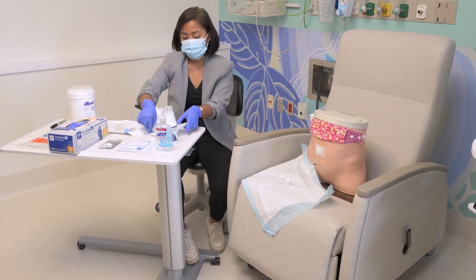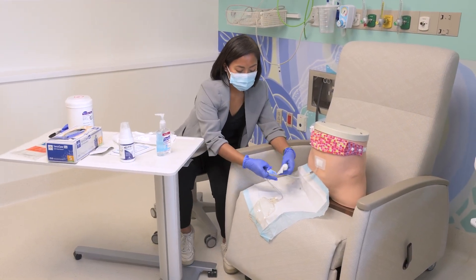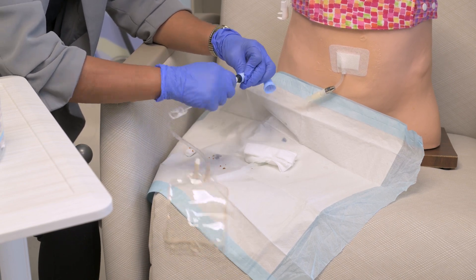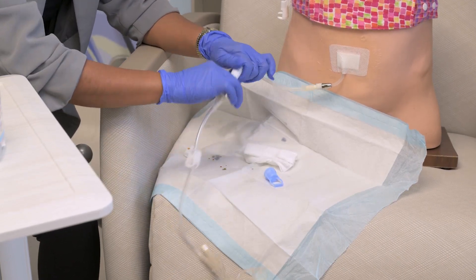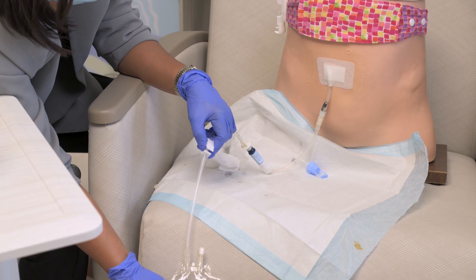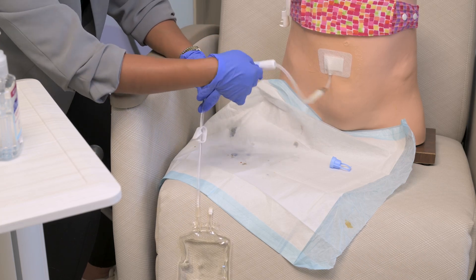During the soak, gel your hands and put on new gloves. Hold the transfer set and remove the mini-cap. Attach the effluent sample bag to the transfer set and open the twist clamp. Be careful not to contaminate. Allow at least 50 milliliters to drain into the bag or until the bag gets at least half filled. Then close the twist clamp on the transfer set and close the clamp on the effluent bag.